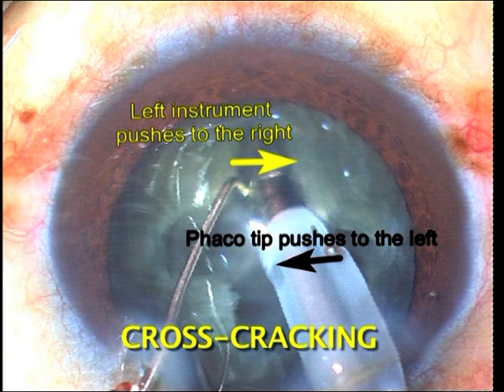Cross cracking is the other technique and is useful when the main and side ports are at 90 degrees to each other. In this technique, the two instruments are placed within the groove and are pushed to the opposite side in order to create the two hemisections.